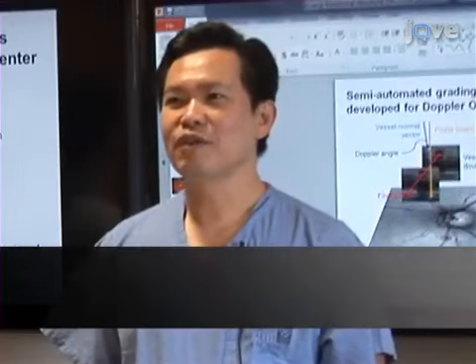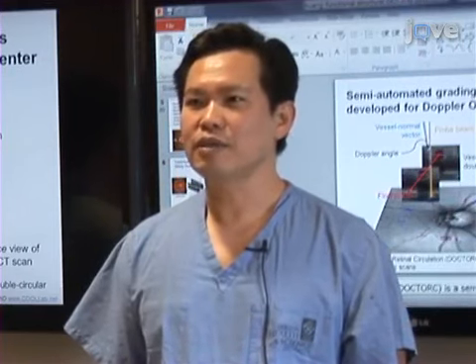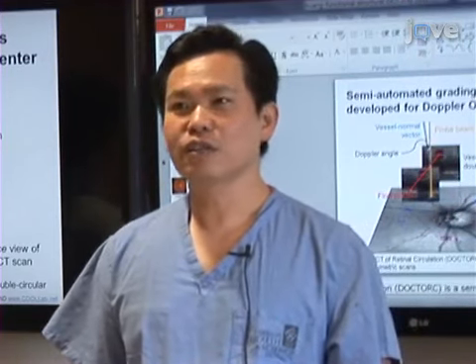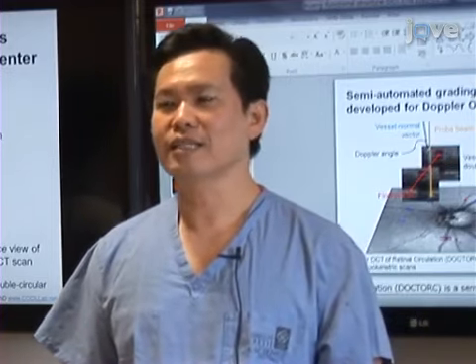The main advantage of this technique over existing methods such as laser Doppler techniques and ultrasound color Doppler imaging is that it provides total retinal blood flow measurements using scans taken in just 2 seconds.